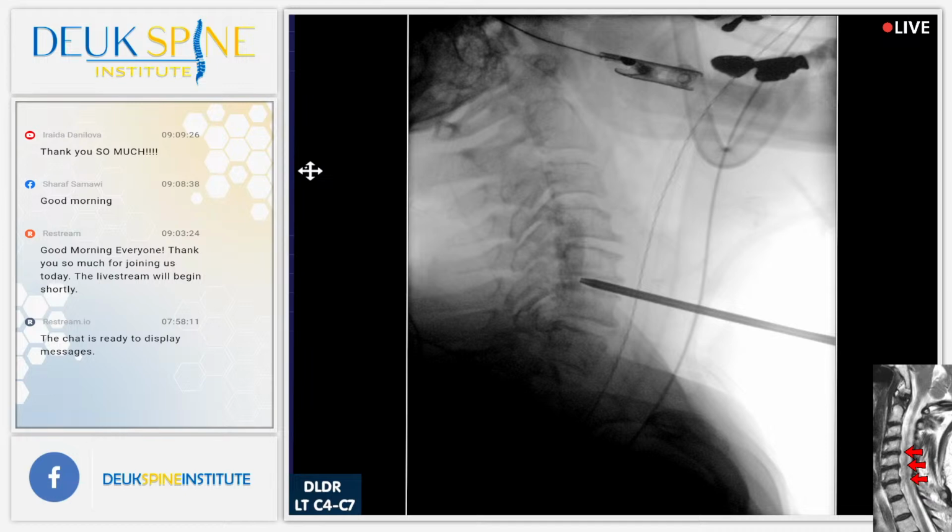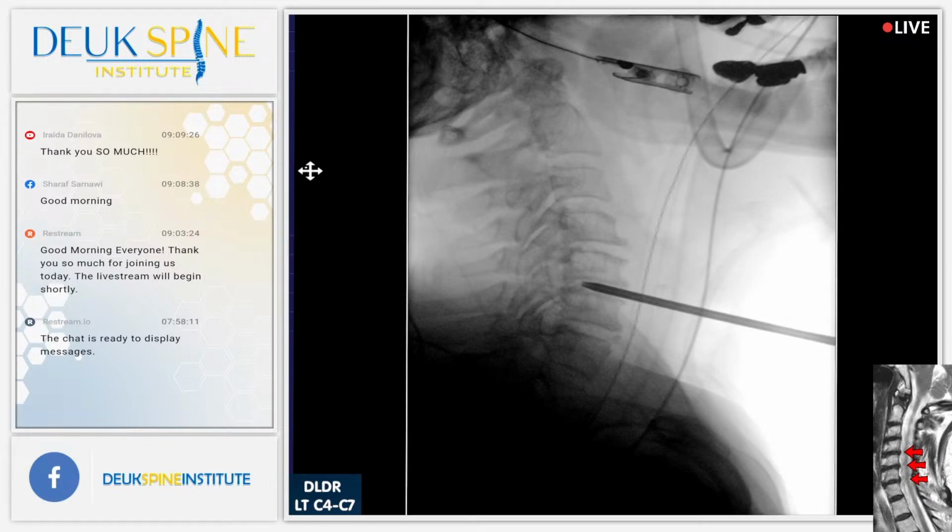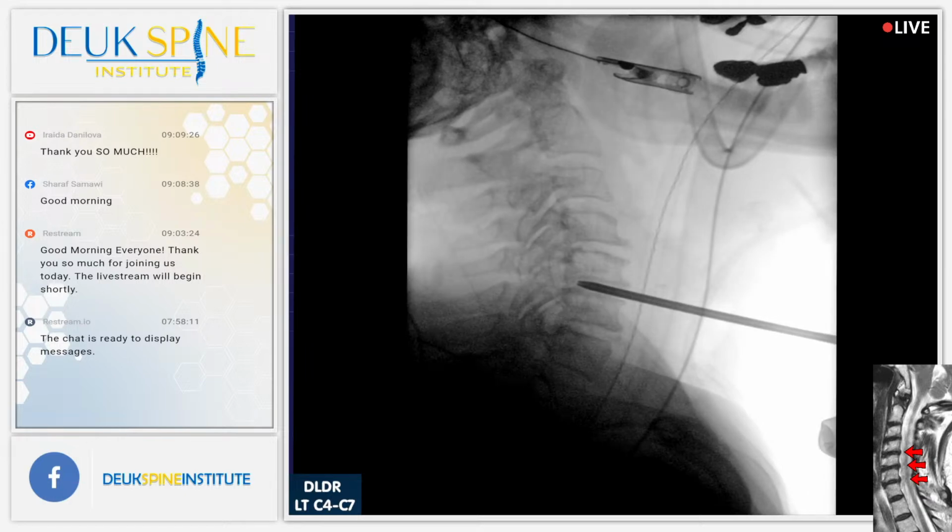Hold that. Shot. Huh, went away. You see that? That was the water. Irrigation, I should say. Boy, that is a collapsed disc. That's why. It's got a lot of scar tissue here.